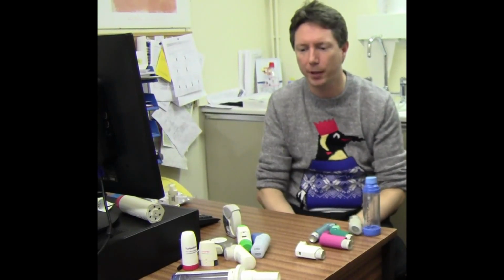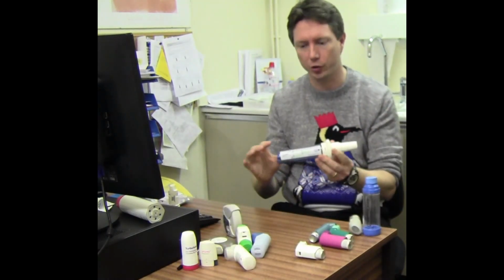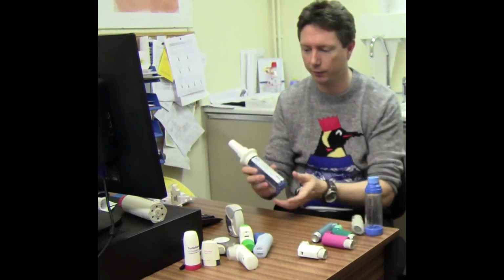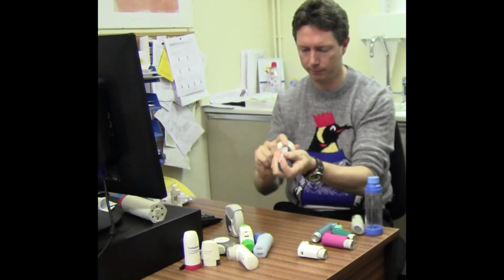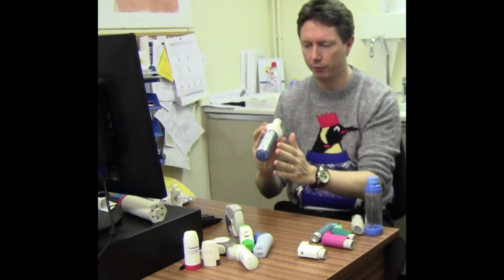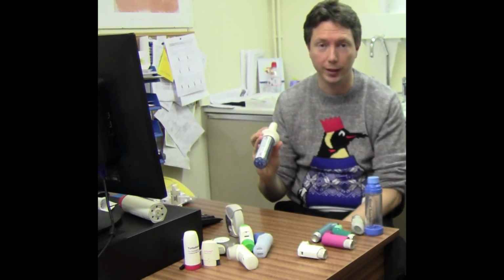One way that you can check whether a patient's got enough inspiratory flow, or getting the right flow, and even help to train them, is with an In-Check device, and there are different versions of this on the market now. For example, if a patient's using the Turbohaler, you can find the setting for that on here. You've set the machine, and you ask them to breathe in as hard and as fast as they would do normally.